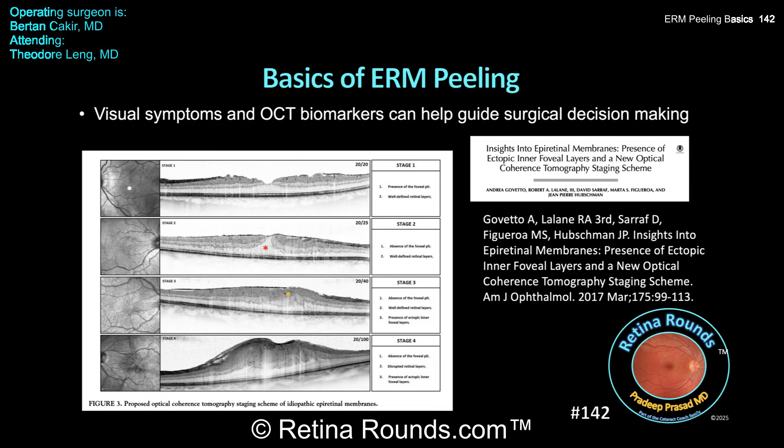In the stage 3 OCT, ectopic inner foveal layers overlying the fovea are highlighted by the yellow star. The stage 4 ERM additionally shows disorganization of the inner layers of the retina, which is very similar to the ERM presented in today's video.